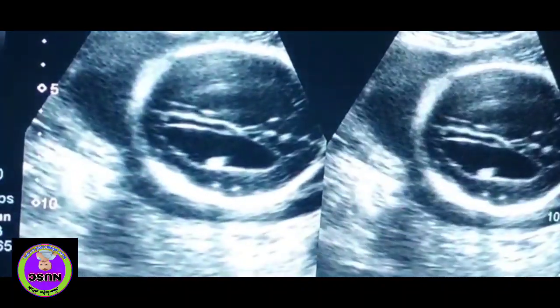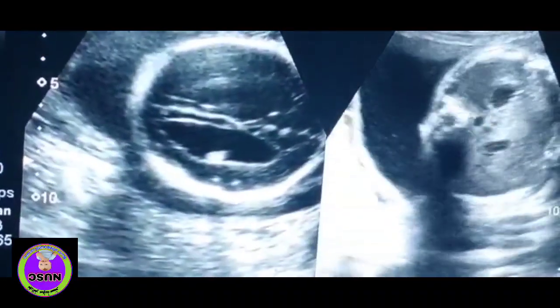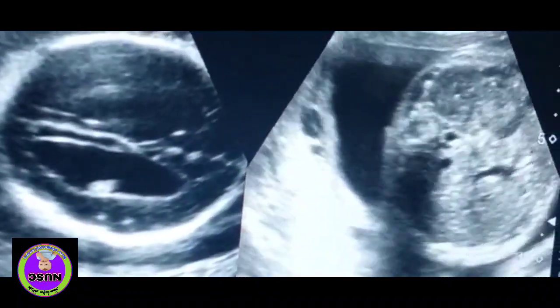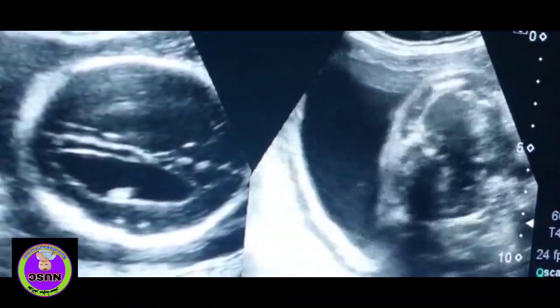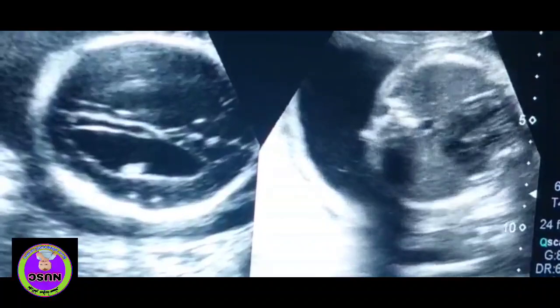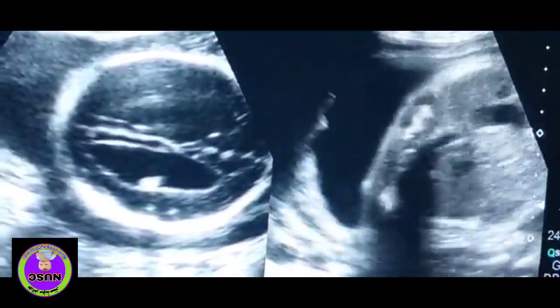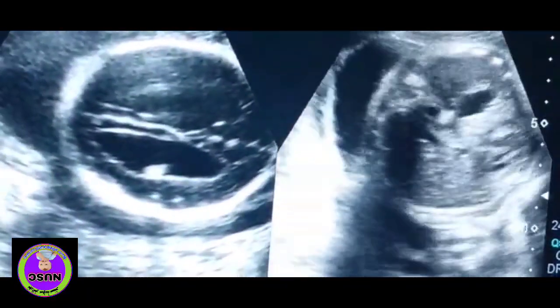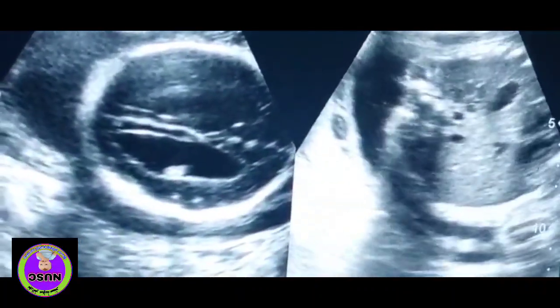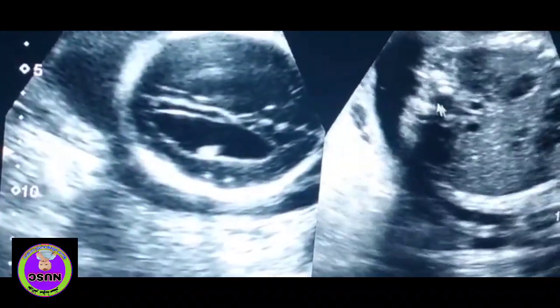Now we come to the spine — the fetal spine in cross-section. Here you see this white is intact skin, and it is present. But as we come down, at this level, there is no skin cover. No skin cover here. And this is open spina bifida.